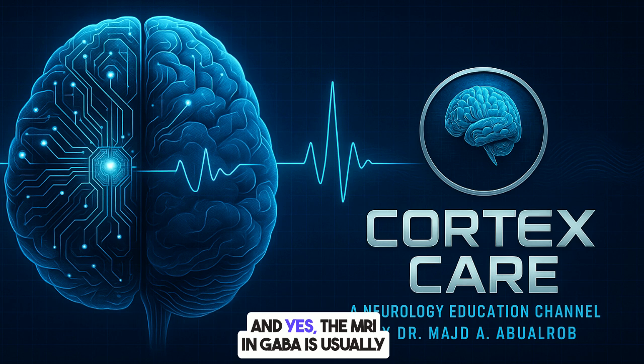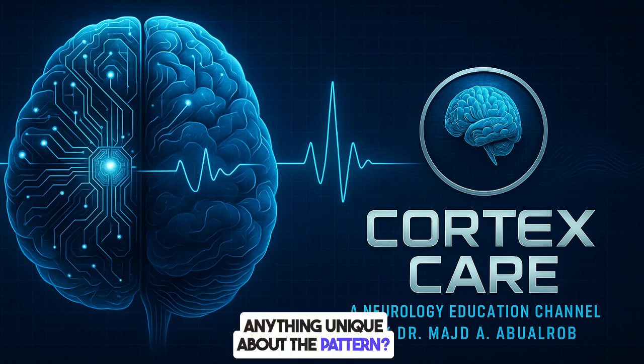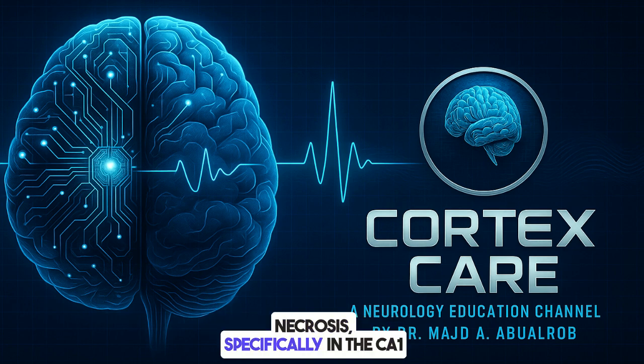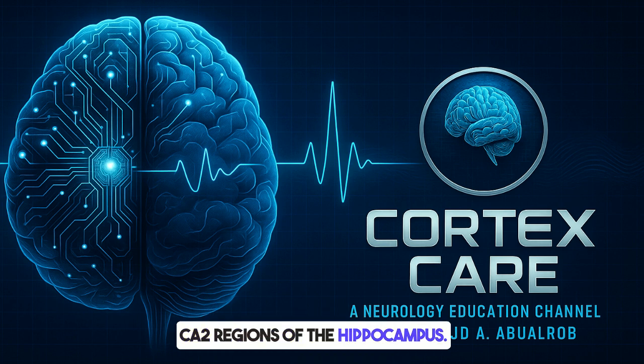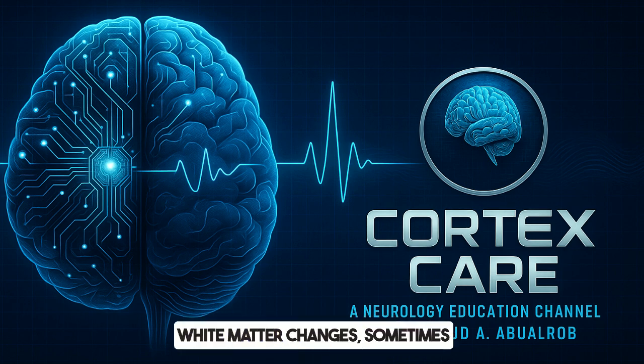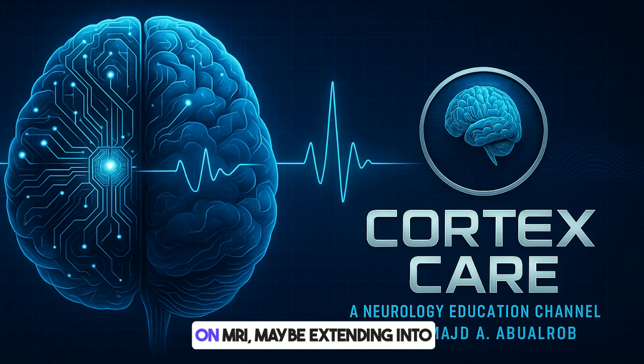It really does. And yes, the MRI in GABA B is usually consistent with limbic encephalitis. Most patients show T2-FLAIR hyperintensities there, like in Figure 5. Anything unique about the pattern? Well, some individual cases have shown a pattern that looks a bit like laminar necrosis, specifically in the CA1, CA2 regions of the hippocampus. Okay, that's specific. Yeah. Other findings can include general white matter changes, sometimes suggesting reduced blood flow, like diffuse ischemic lesions. And if there's cerebellar involvement clinically, you might see matching bright spots in the cerebellum on MRI, maybe extending into the brainstem or basal ganglia.